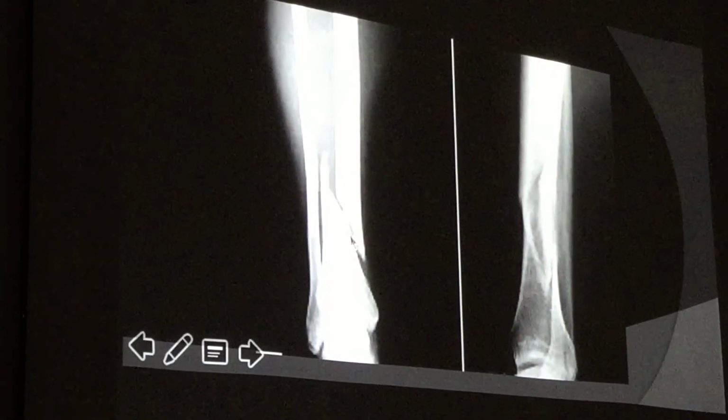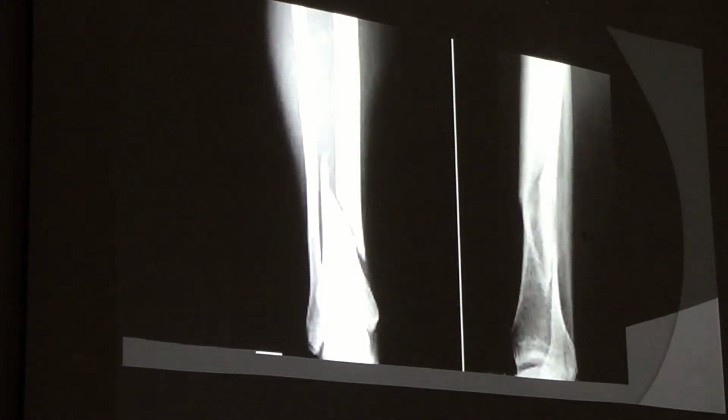And another example is here, again another spiral fracture involving the distal tibia. So, a complete spiral fracture of the distal tibia with slight displacement of the distal fracture segment. Okay, but basically those examples are used for the long bones. How would you evaluate for fractures in other parts of the body?